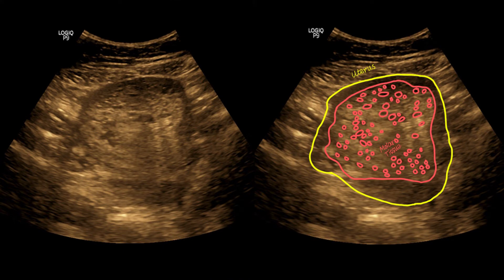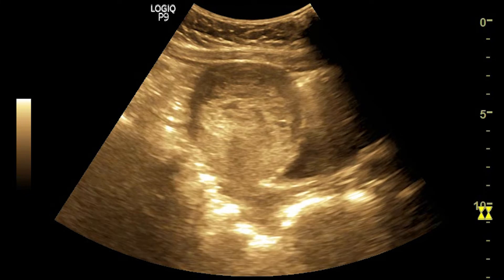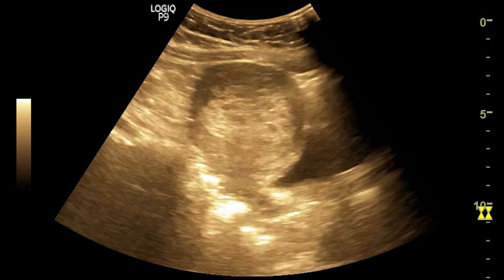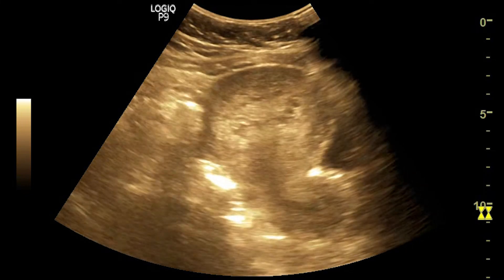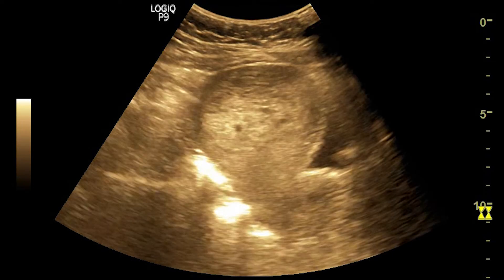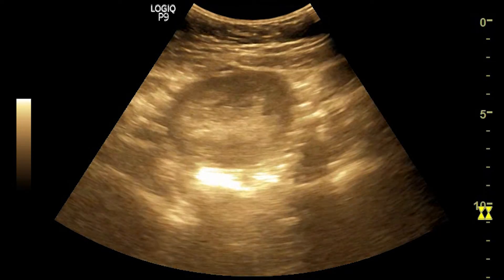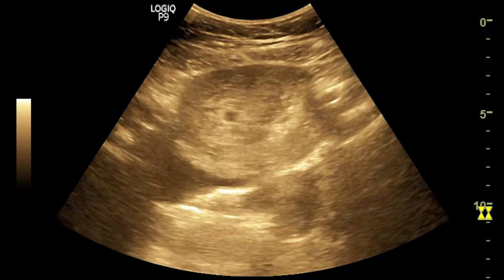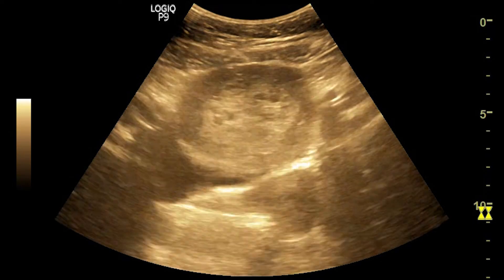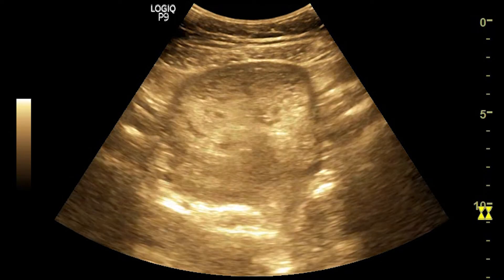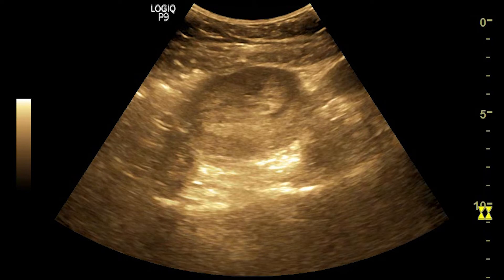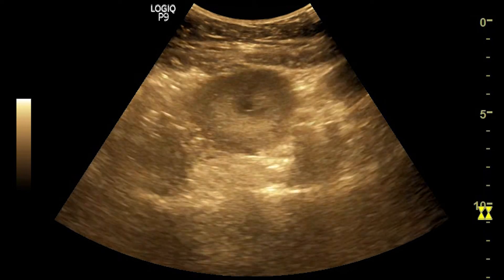Now let's check in real time. This is the longitudinal cut, and this is the transverse cut. You can see the partially filled bladder. No definite fetal pole is seen. The molar tissue has completely filled the uterine cavity.